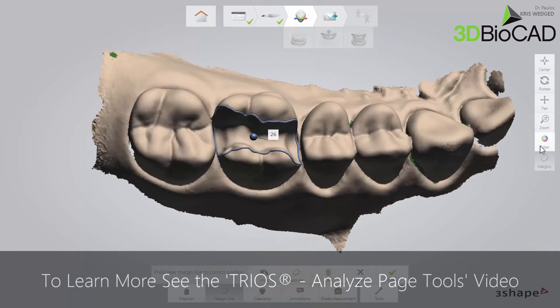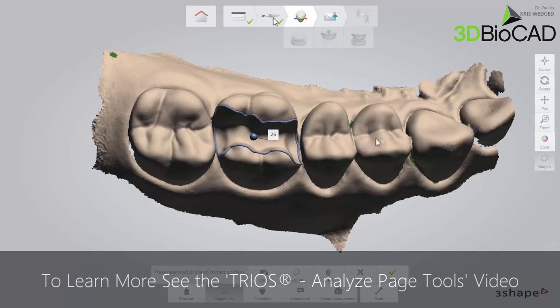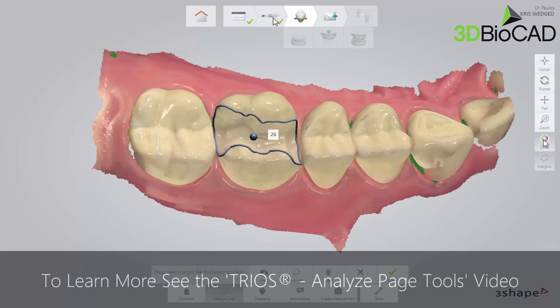Optionally, you can set the margin line. You can also add some comments on the 3D scan using the annotation tool. To learn more, see the TRIOS Analyze Page Tools video.